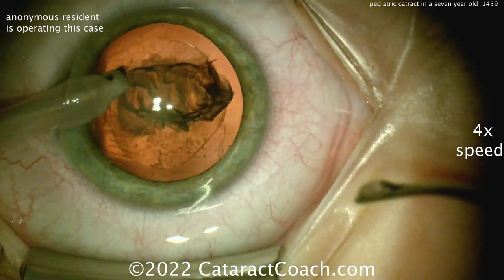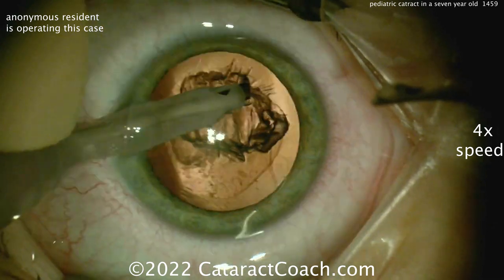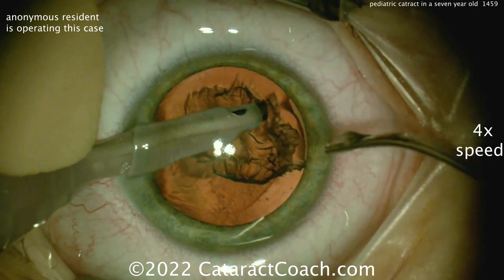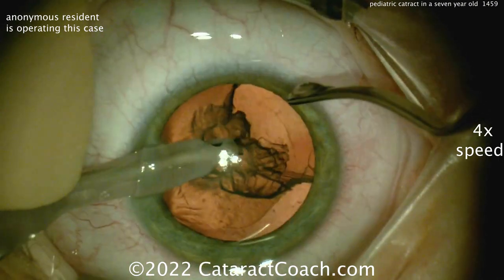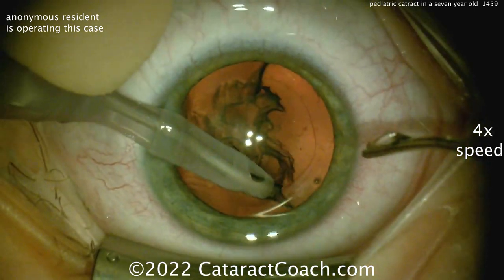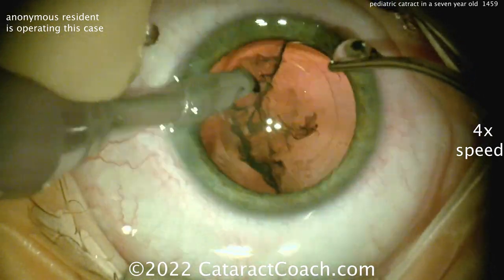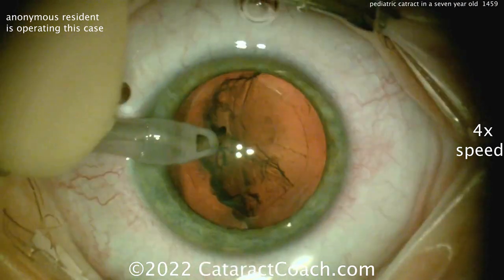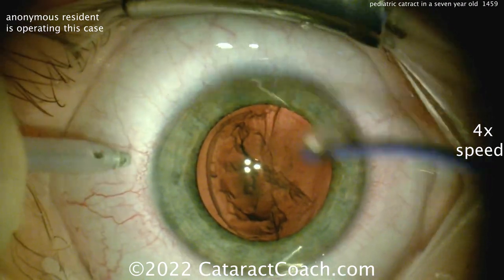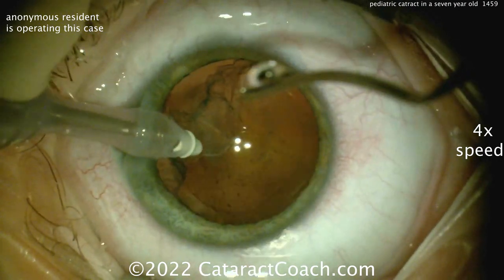Single-handed technique — I like this. I would do some hydrodissection here. The lens is going to be soft — butter soft. You don't need any ultrasonic power; this is all vacuum only. What I do is just use the BSS on a cannula to hydrodissect and get that whole nucleus up out of the bag, and then you can actually remove the entire thing with just the IA probe. The FACO probe certainly does work here — you can see how quickly it's aspirated out of the bag — but bimanual irrigation-aspiration is good enough. The whole nucleus can be removed with just the IA probe; there's no need to do the FACO probe.